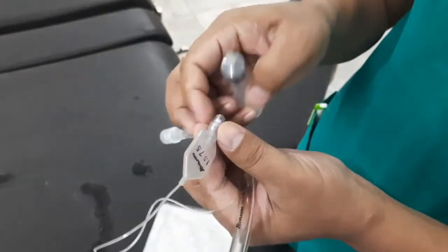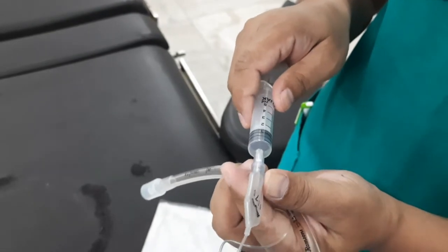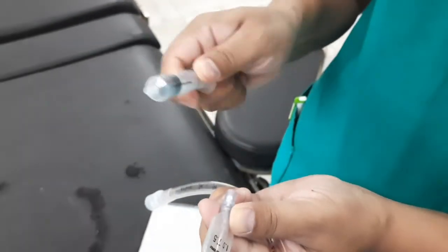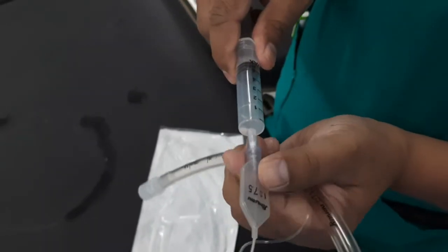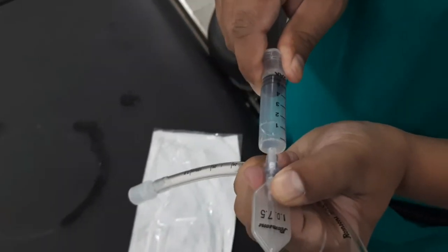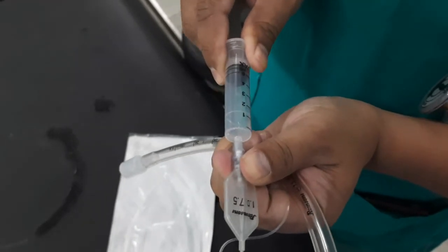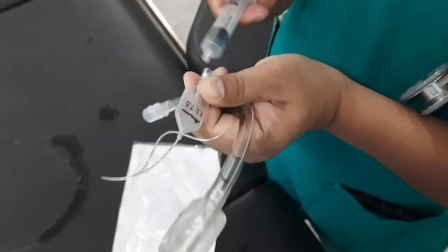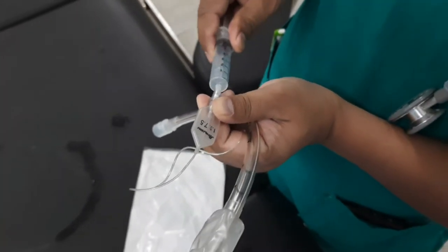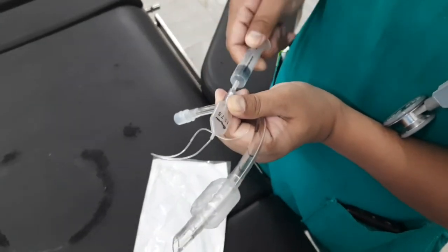After intubation, the cuff is inflated with air. This is done by attaching a syringe to the pilot balloon. The pilot balloon is connected to the cuff by a thin tube. As the syringe supplies pressurized air, the pilot balloon and cuff inflate. Once the cuff is inflated, the syringe is removed. Air does not leak out as there is a one-way valve at the pilot balloon.